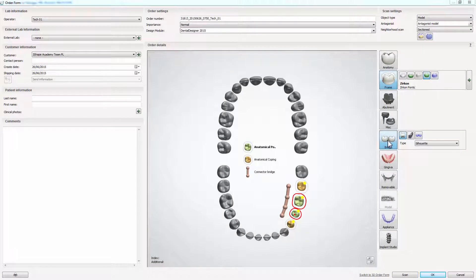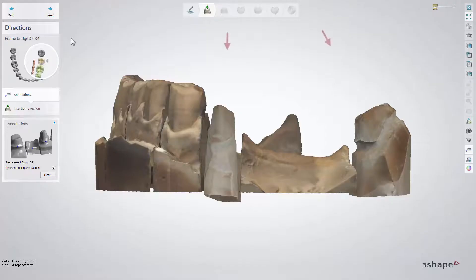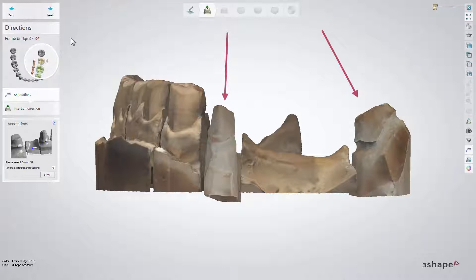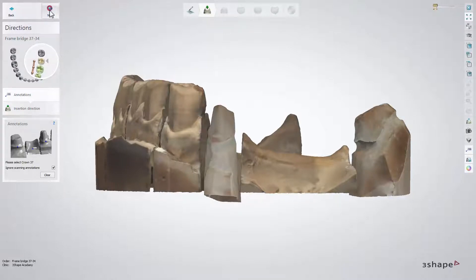For this video, we will use an anatomical frame bridge case. As you can see here, with a case like this, we would have problems designing a one-piece bridge that fits well on top of these two dies because of the big difference between the insertion directions.